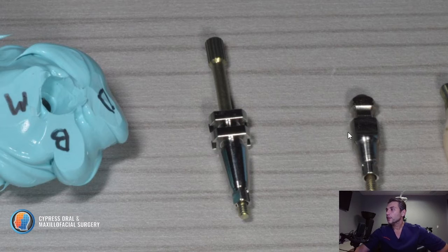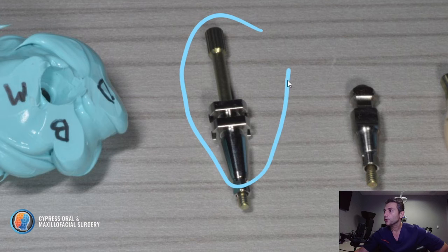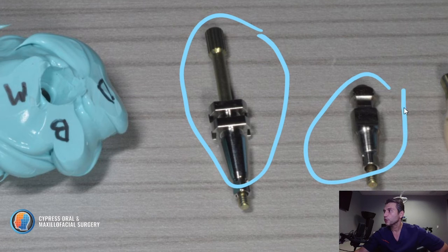What I end up using here is an open tray impression coping. I feel like open tray gives the laboratory more information. It's more accurate. It doesn't move. This is what the open tray impression coping looks like, and this is what the closed tray looks like. You can use a closed tray as well, but in this case I opted for the open tray.